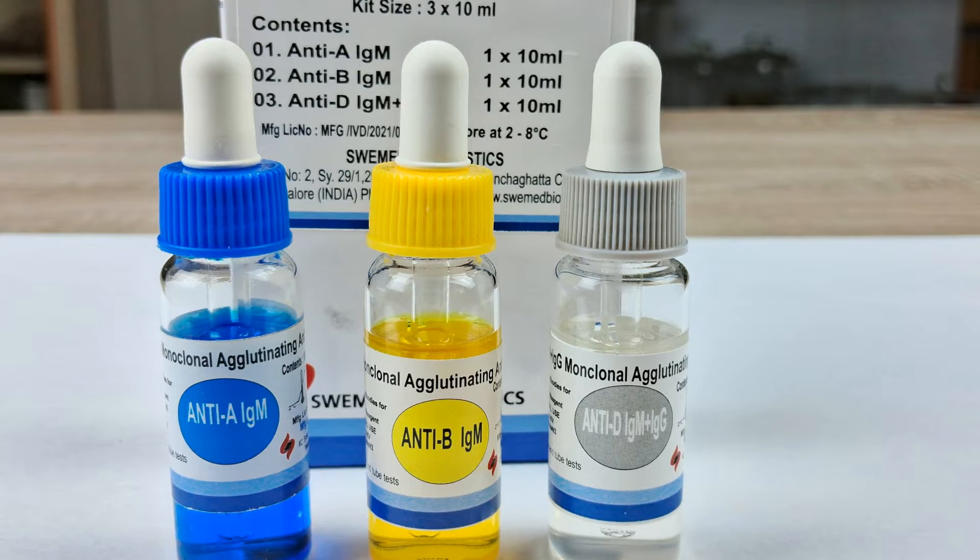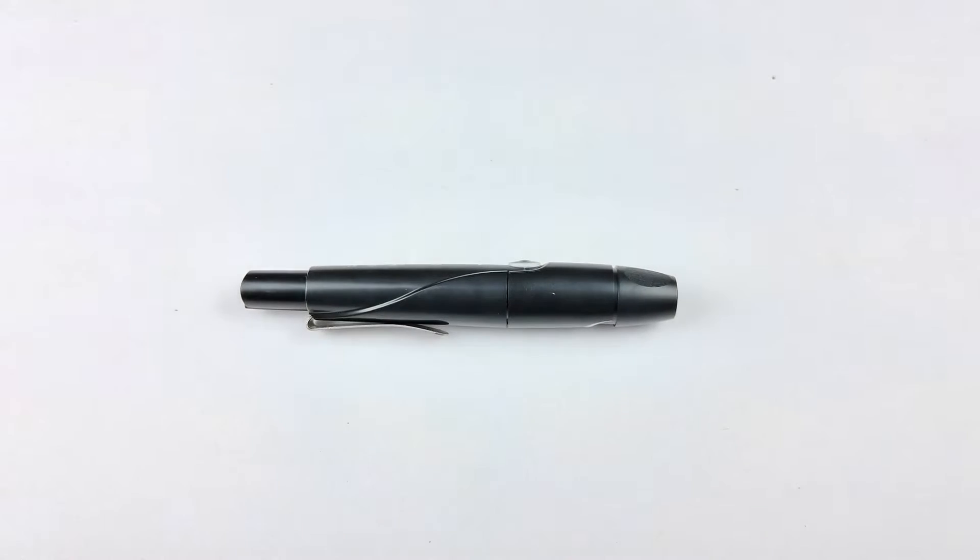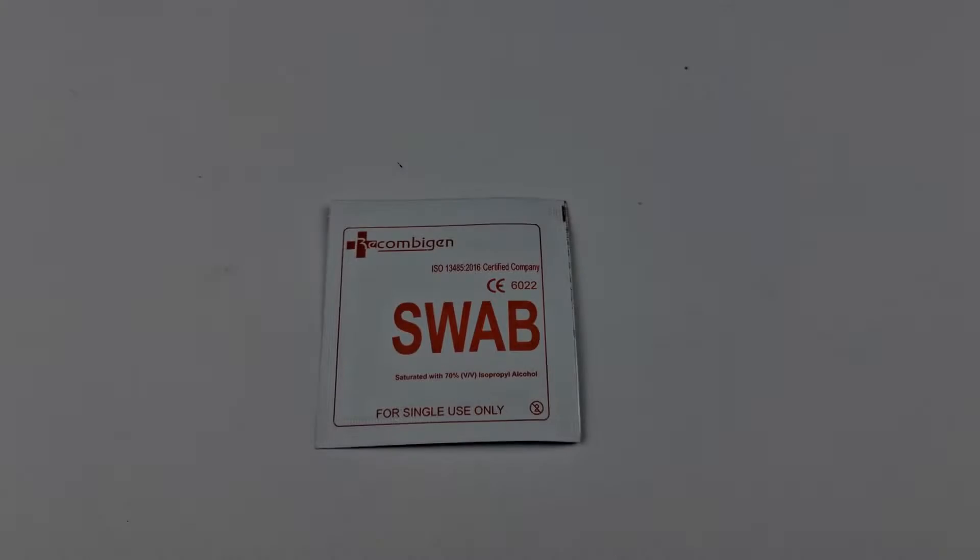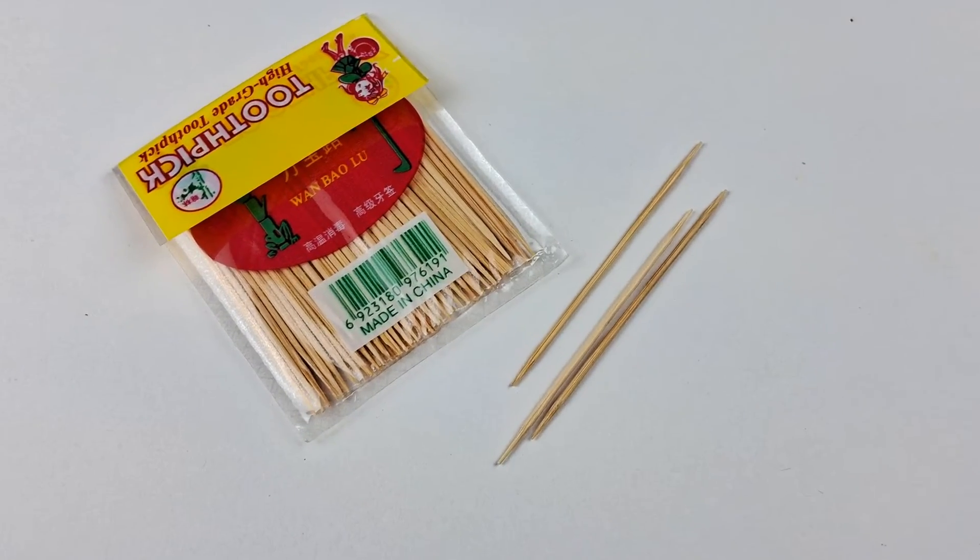To perform the ABO and RH blood grouping test, you'll need the following: a clean glass slide or a white porcelain tile or a VDRL test plate, a pricking device such as a lancet or pricking pen, an alcohol swab or a cotton moistened with rubbing alcohol, and toothpicks, match sticks or capillary tubes.